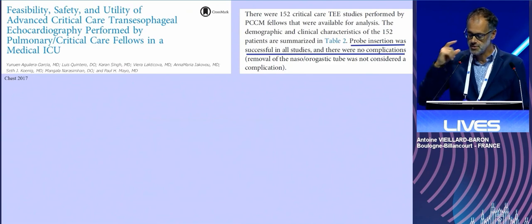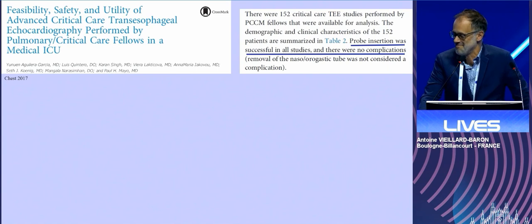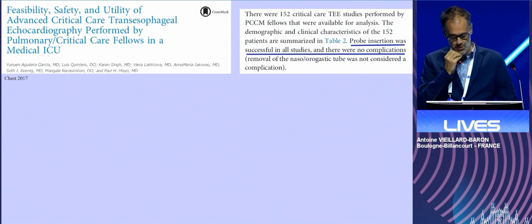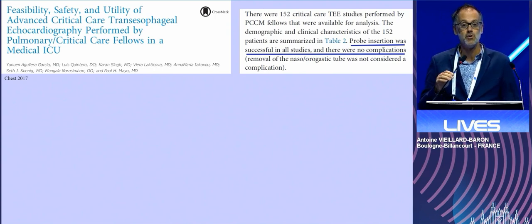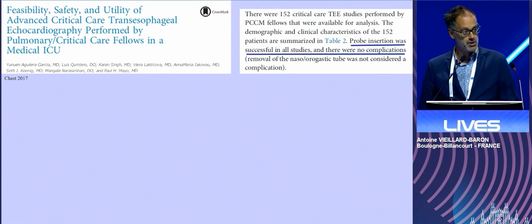This study is really nice and was a little bit surprising for me. First, because this is TEE coming from North America, so sorry, Stephen, but it's unusual, I will say. It was performed by fellows in New York City. You can see that the probe insertion was successful in all studies, so it's not so complicated to put a TEE probe into a patient if the patient is sedated and ventilated.